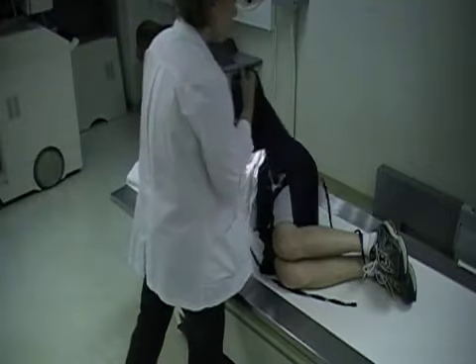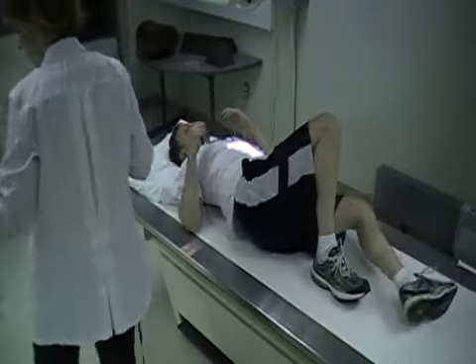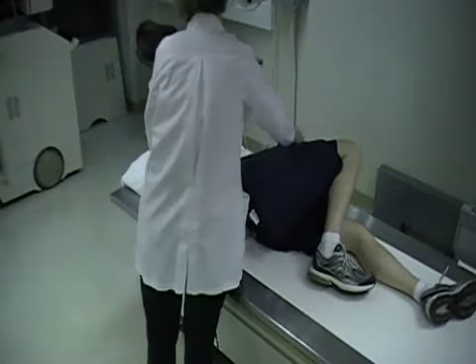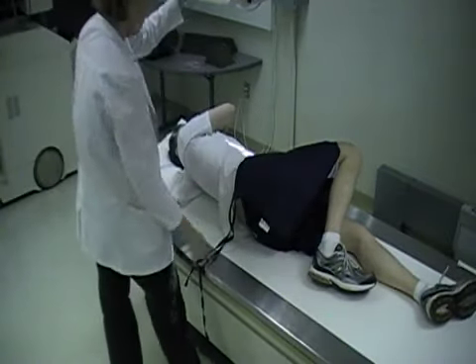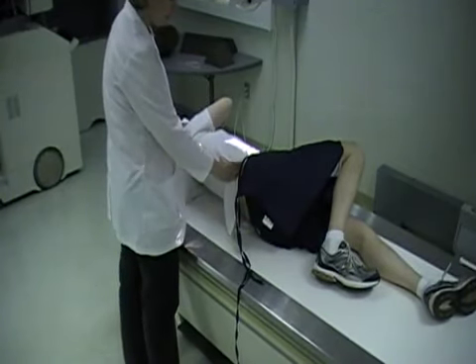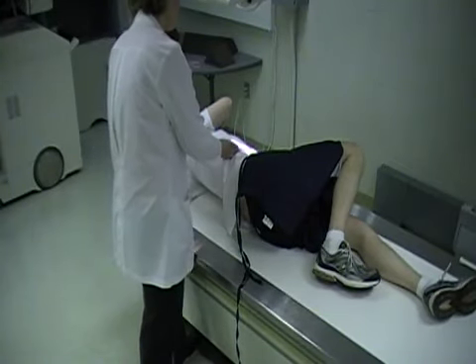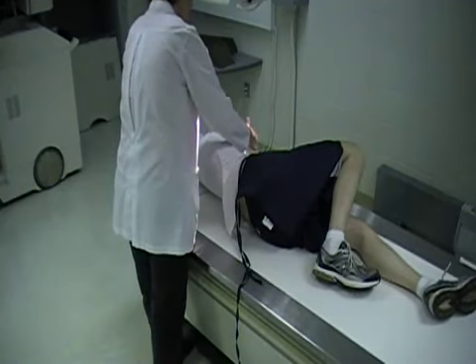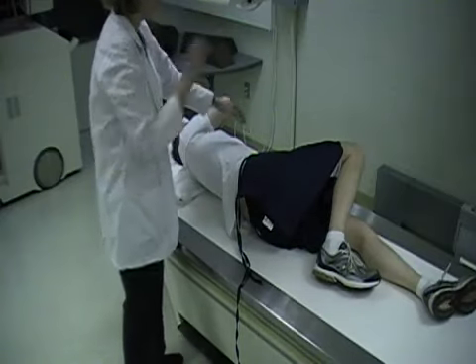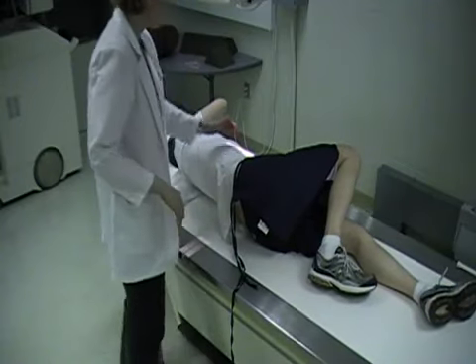Okay, and then for the LPO, roll to your left side. Palpate the bottom border of the ribs. Transverse line is going to be 1 inch to 2 inches above that. And then I'm going to palpate where his xiphoid process is and that opposite border of the body, and you can go halfway in between that to get the stomach.